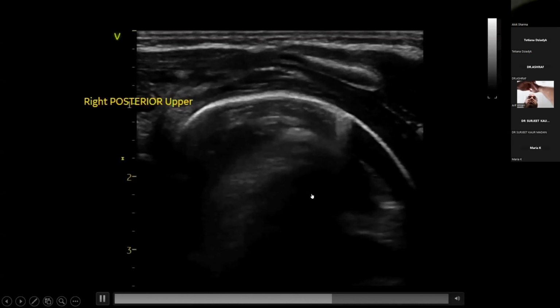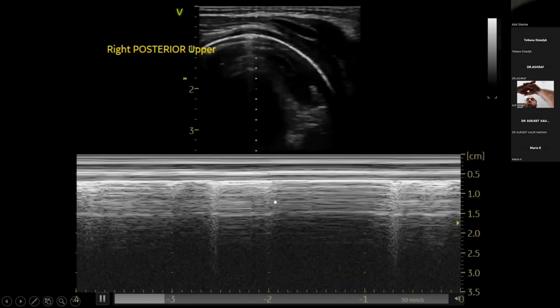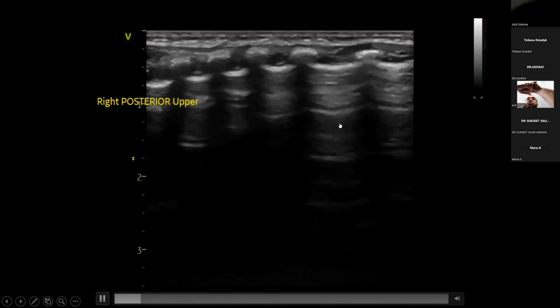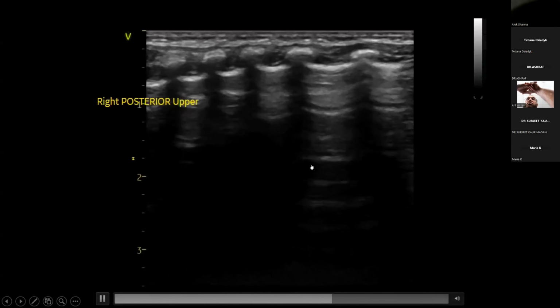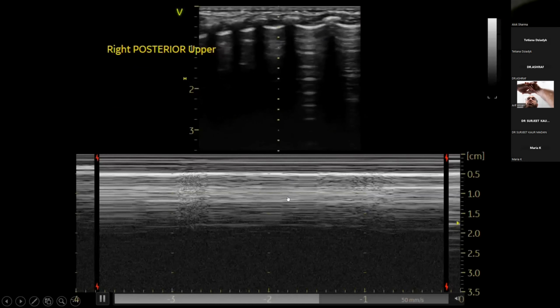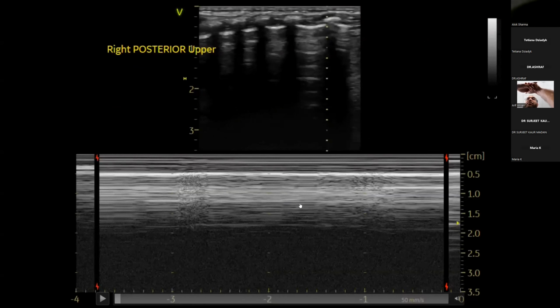Yeah, very nice. Beautiful. So maybe this one, maybe he's not sliding there. But I'm not convinced. Let's go back. I will manage this in a different way.